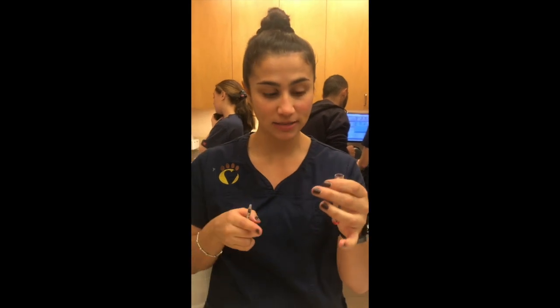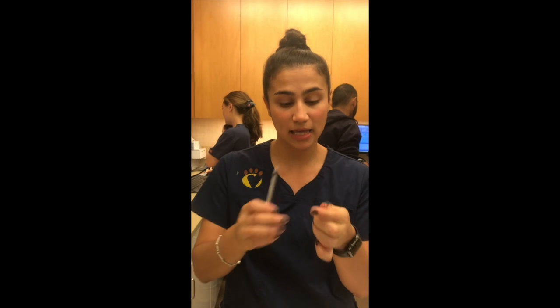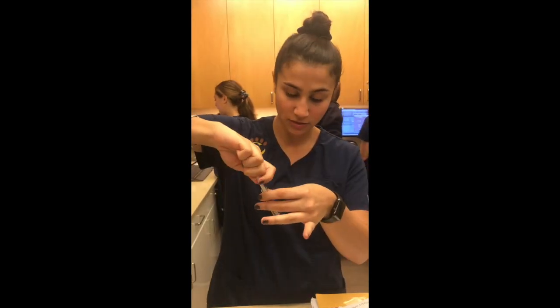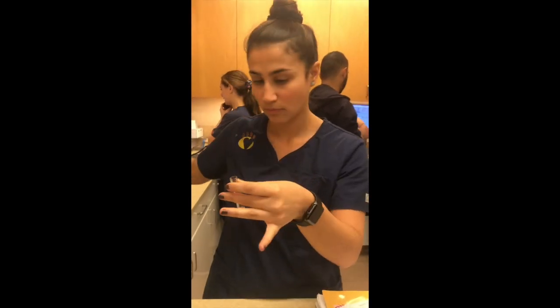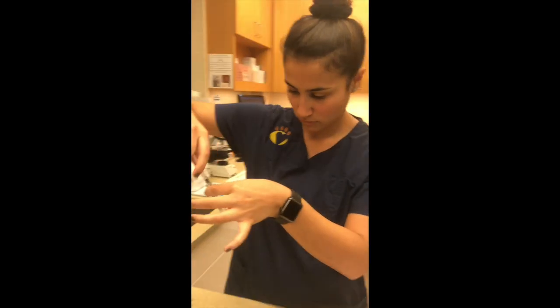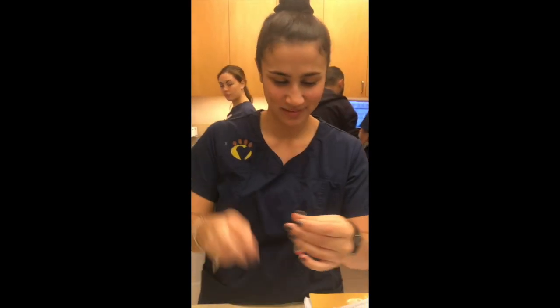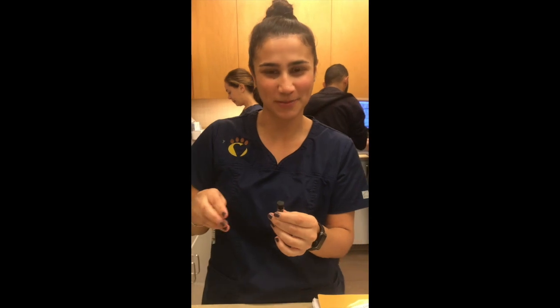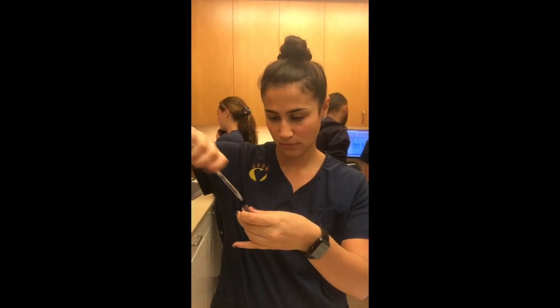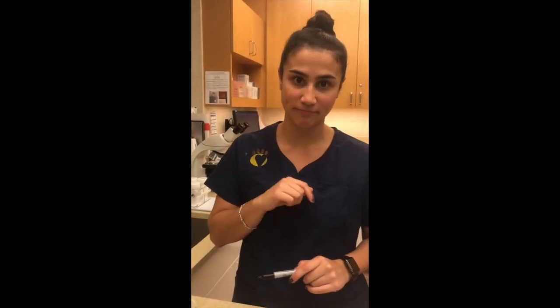Okay, so we have our recipient tube that only spun once for 1 minute. So now it's still tinted a little red. So first I'm just gonna decant the supernatant. Make sure I'm very careful. Okay, good. And now I'm gonna do it for our donor blood as well. And now we will spin both of these tubes down for 1 minute.